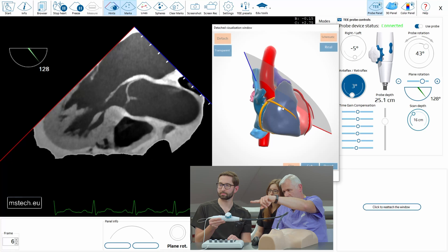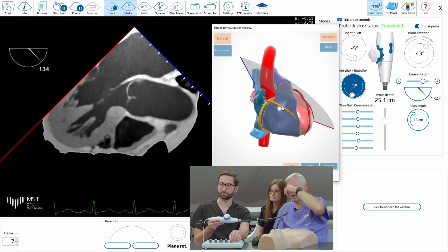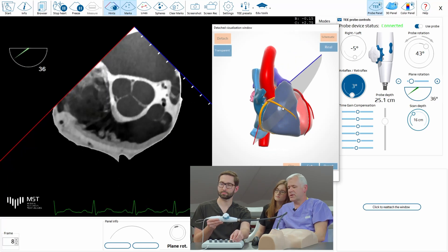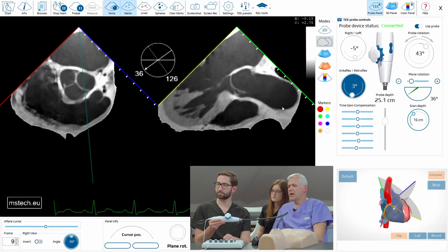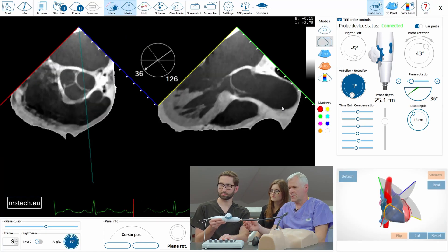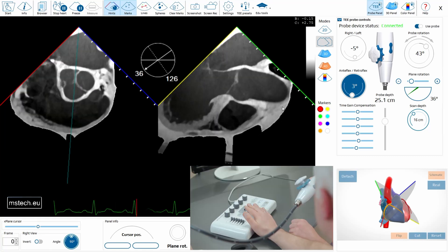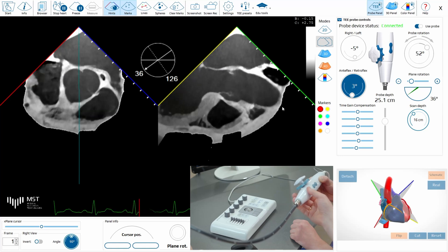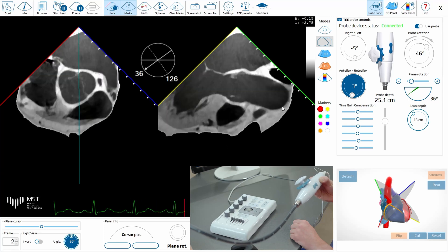You can also use the X-Plane to see it. Come back to 35 degrees and press the X-Plane button. Put the line just in the center — keep this valve in the center as well. Then you will see exactly the cross-sectional view of this.